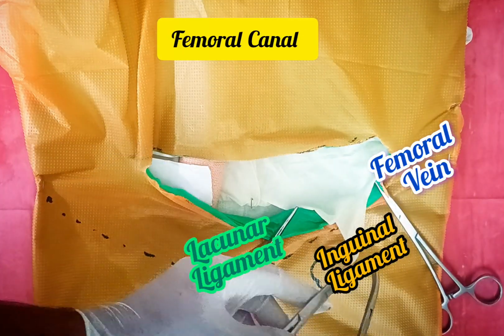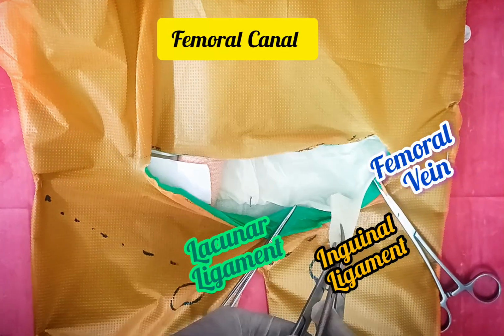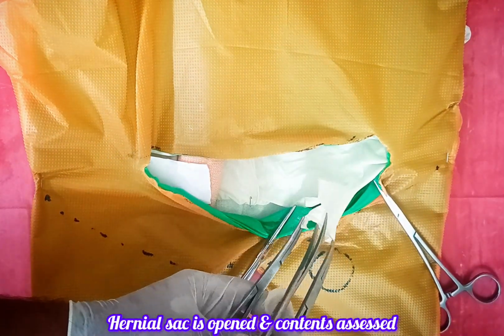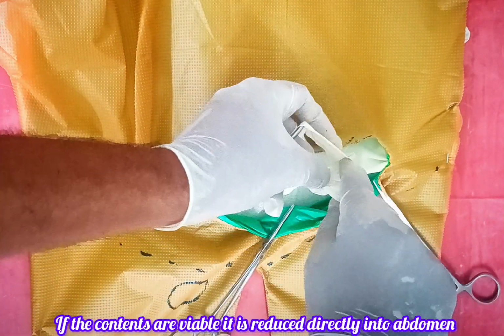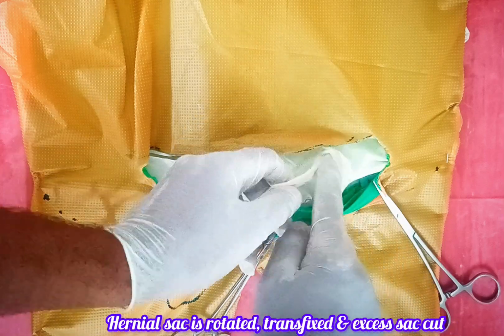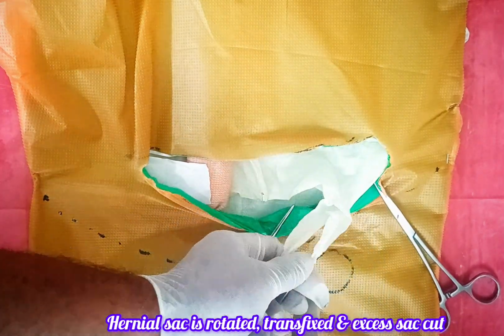Femoral canal is closed after repairing the hernial sac. Hernial sac is opened and contents assessed. If the contents are viable, it is reduced directly into the abdomen. Hernial sac is rotated, transfixed, and excess sac cut.